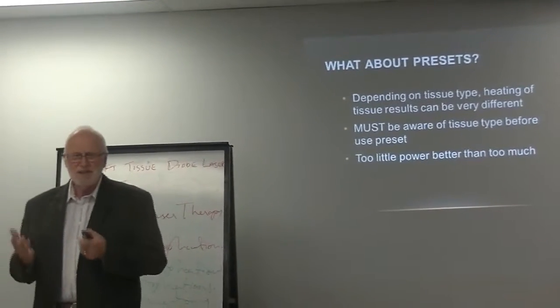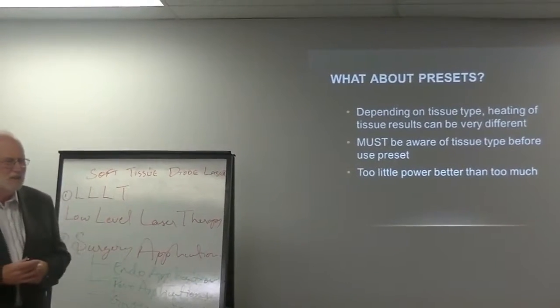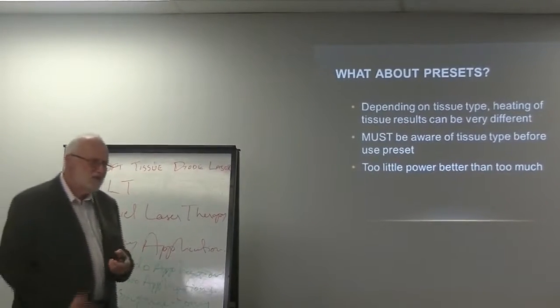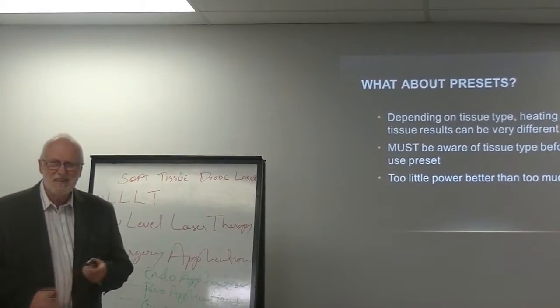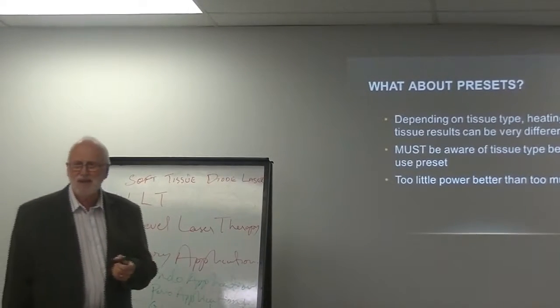Presets are a good place to start with, look at them, get an idea. But in terms of doing procedures, that shouldn't be your guide. As you start, I would say within 2 months of using a laser, you should never use a preset again. I haven't used a preset in I don't know how many years.